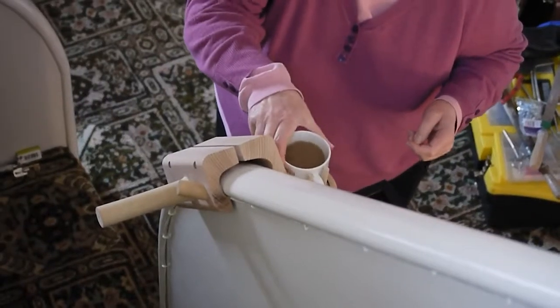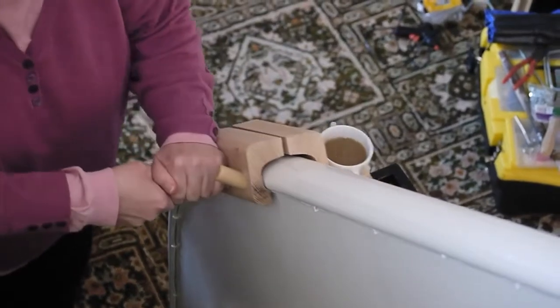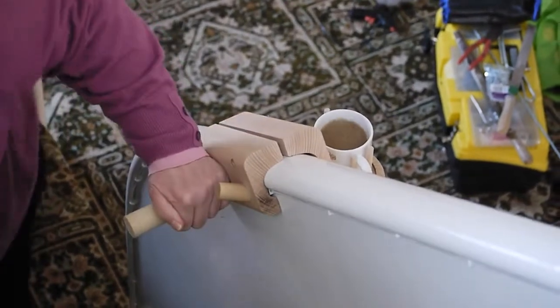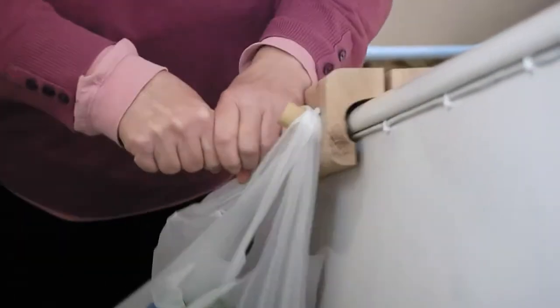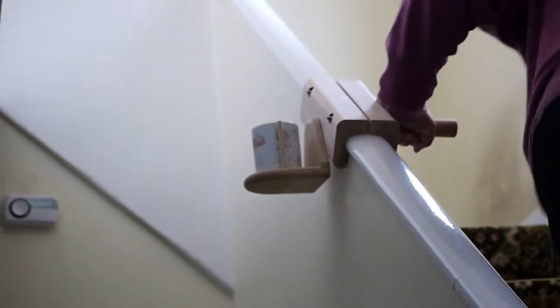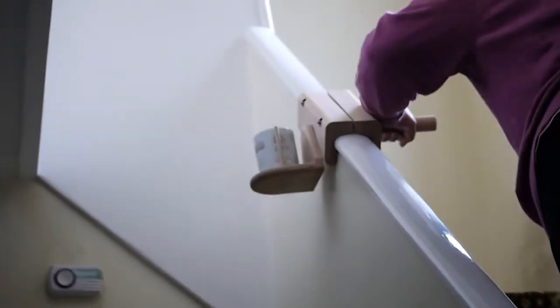I think the standard cup holder was more useful because I'm more likely to use an ordinary cup in the house. Being able to put something on a bag and then take it up the steps with me as I go is very useful. Also, the fact that the handle comes out sideways to the stairs is useful — I feel more balanced with it rather than having a handrail at the side.